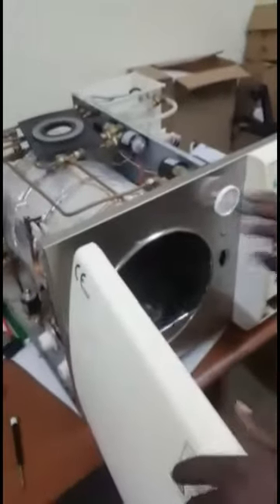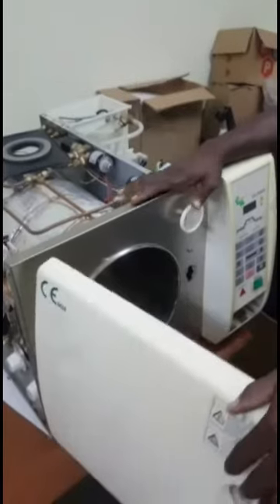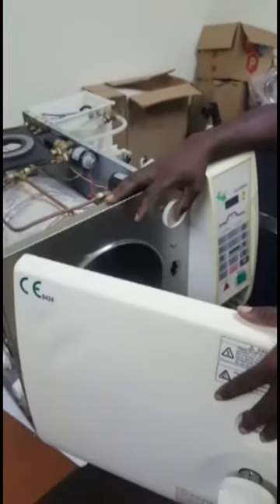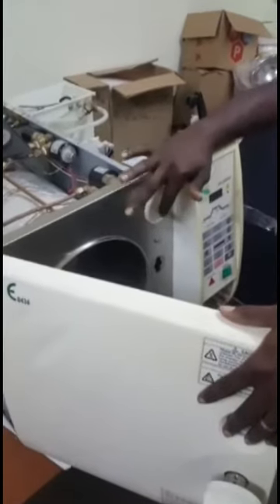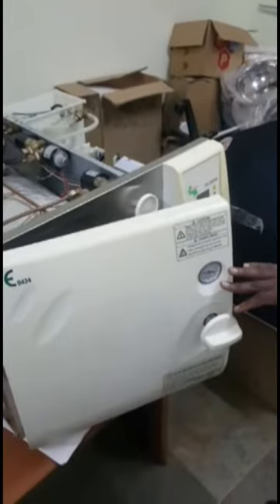When this filter is dirty, it is difficult to open the door after you finish your sterilization, because it is not able to pull air through the filter for the pressure inside the chamber to be equalized or balanced with the atmospheric pressure.